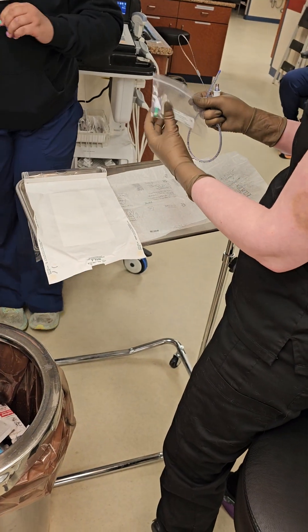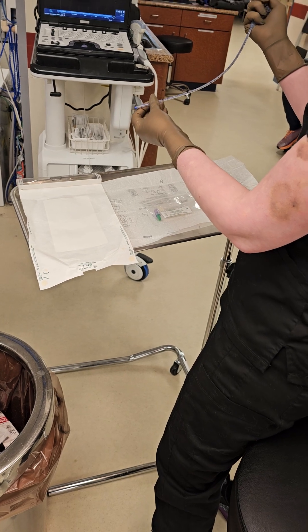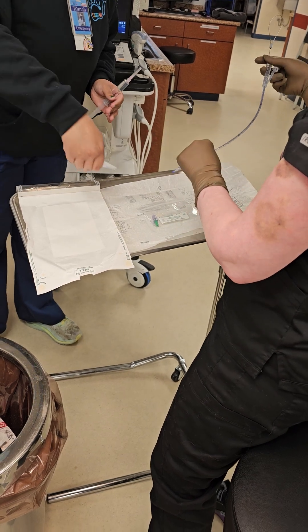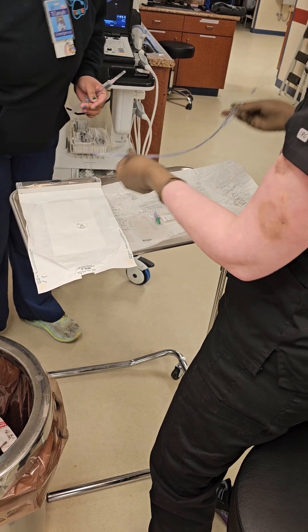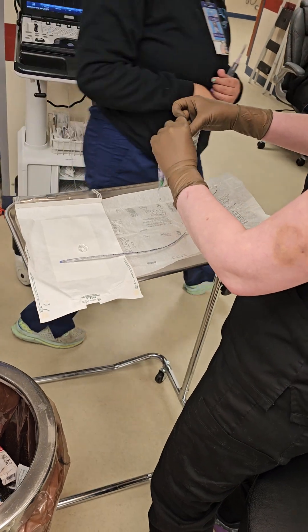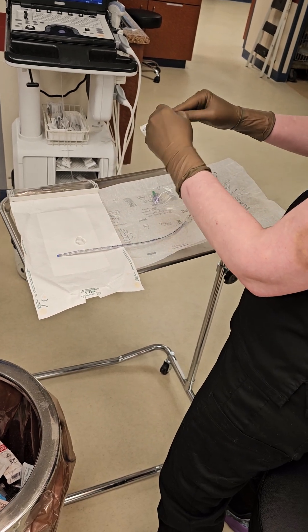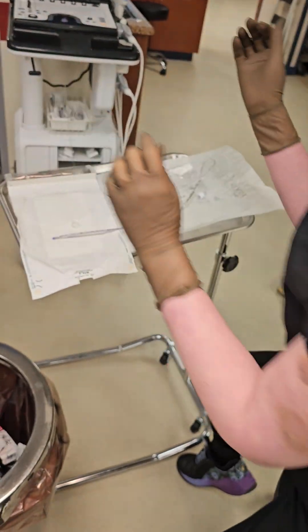This usually has sterile lube in it, but this one doesn't — you can put some sterile lube over here. I have both of these as kind of my sterile field. Over here I also have a urinary catheter bag for collection. Usually I like to have this out of its peel package and open, because otherwise you're trying to open it with gooey lube all over your hands.